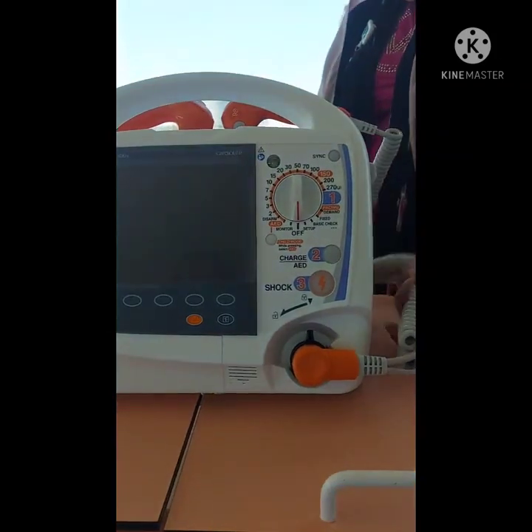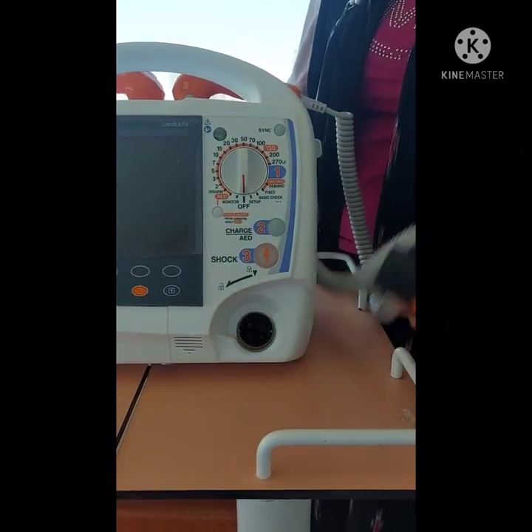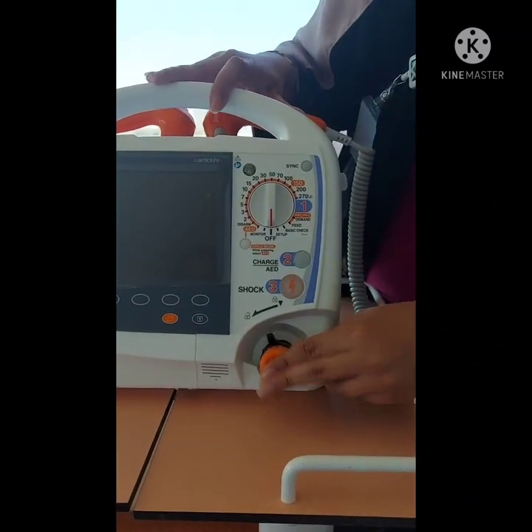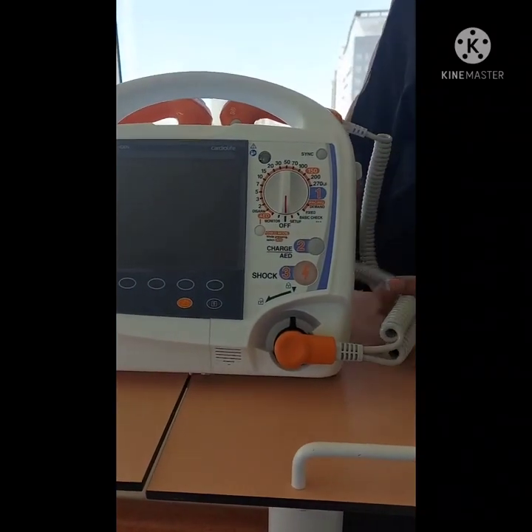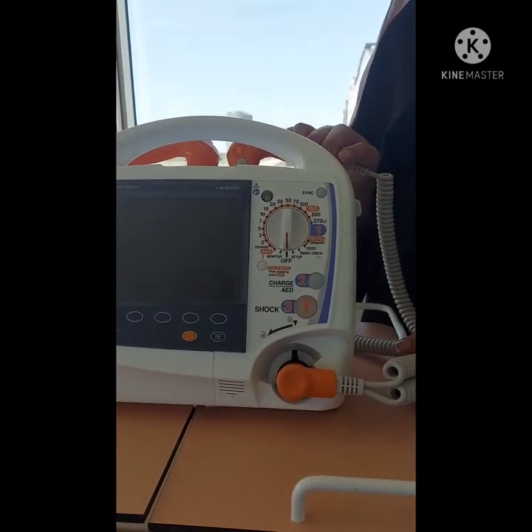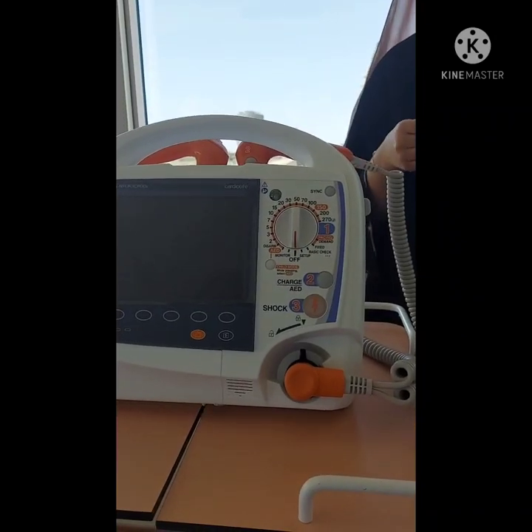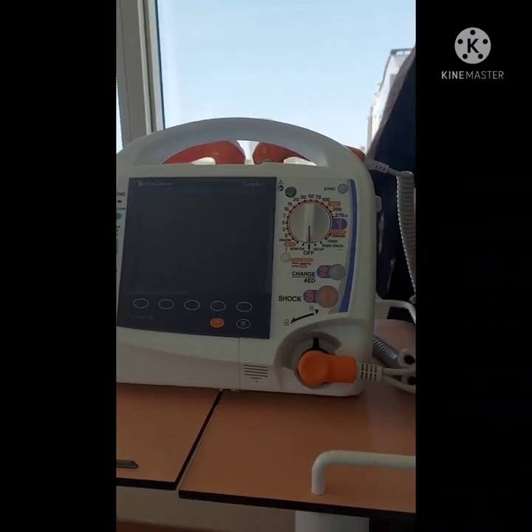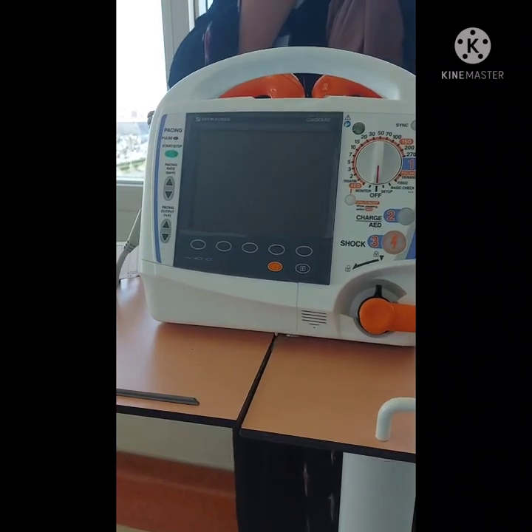Here you have the cable for the paddles and you can disconnect it by clicking on the other side. Okay. And then when you want to put it again, you just have to press and hear the click. We do have another cable and they have it in the biomed. It's for the disposable pads. It's exactly like this one, but at the end it can be connected to the disposable pads, okay? And you can just attach it the same way we attach these. I will try to bring it, so okay, with one of the disposable pads also.